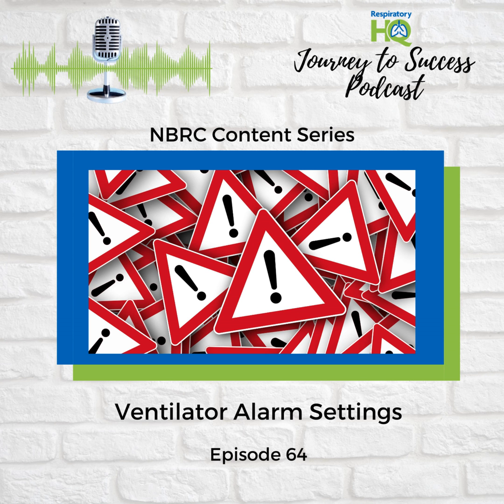The breath itself. Precisely. Output alarms are triggered when something's not right with what the ventilator is delivering or sensing back from the patient. And there are quite a few important ones here. We can start with volume. There's the low exhaled volume alarm.